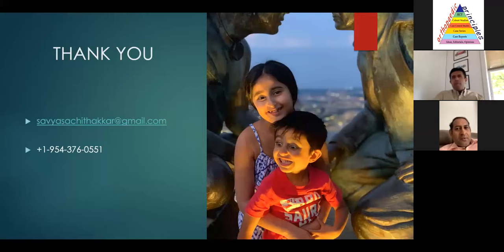Now, I am a press fit person, so I like press fit stems that engage the isthmus. And in those patients, if you try and do kinematics, the stem may end up going out the lateral tibial cortex. So I think that is a problem. So in that obese patient in my hand, if I was a follower of kinematics, I would then switch them to a more mechanically aligned principle or restore kinematics with a kinematically designed implant.